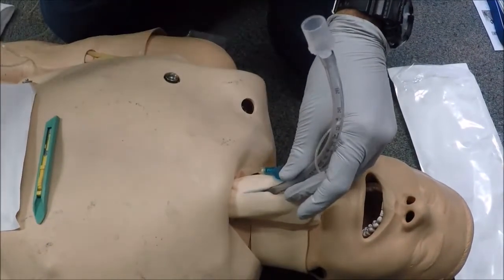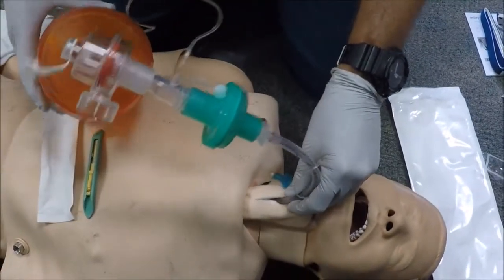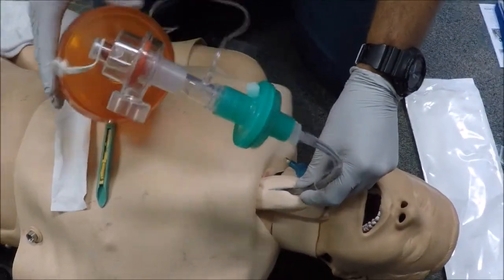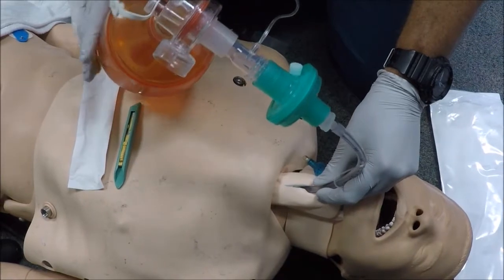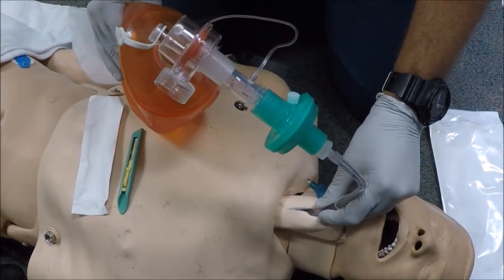And then with our bag valve mask already connected to high flow oxygen and capnography, we would confirm ventilation by the presence of a positive capnogram over 6 different ventilations with adequate tidal volume.